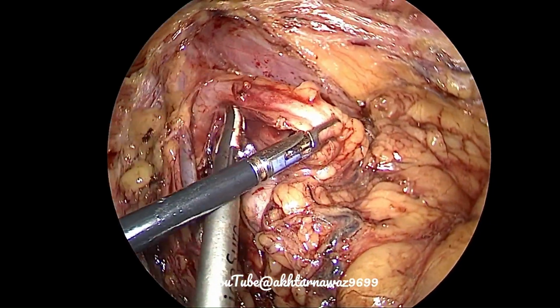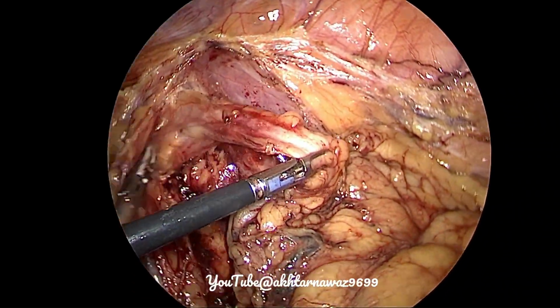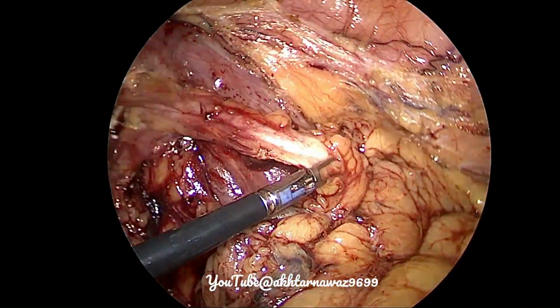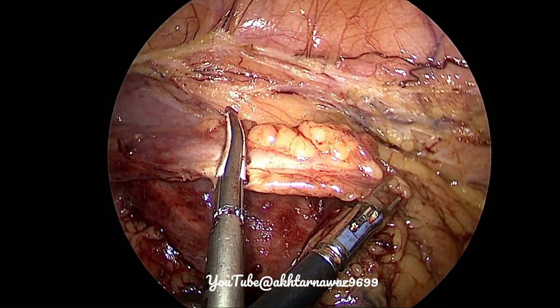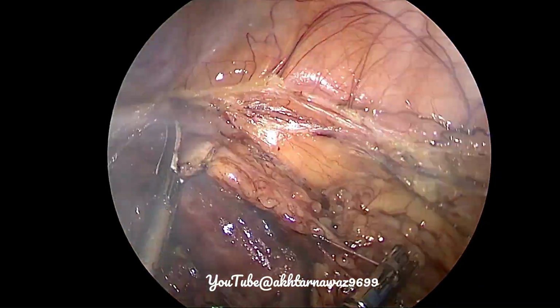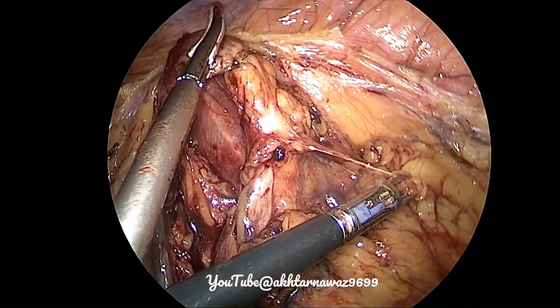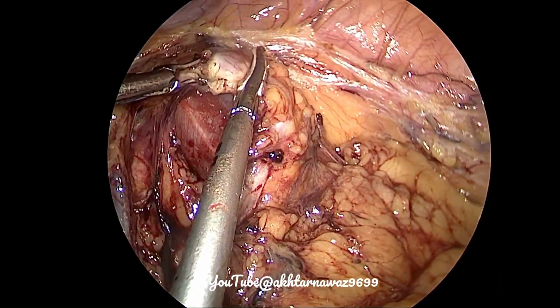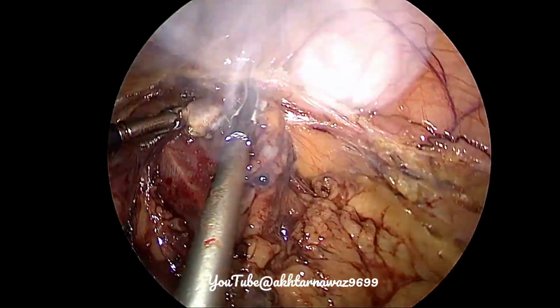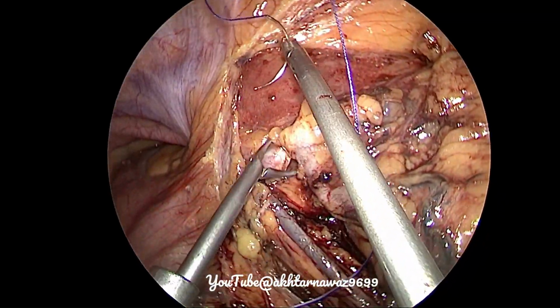to coagulate it with the ligashore distally and proximally, and then cut the ureter, and then apply transfixation suture, intracorporeal transfixation suture, to deal with the ureter. You can see that the ureter is quite thick, and the Hem-o-log clip may not be applied.